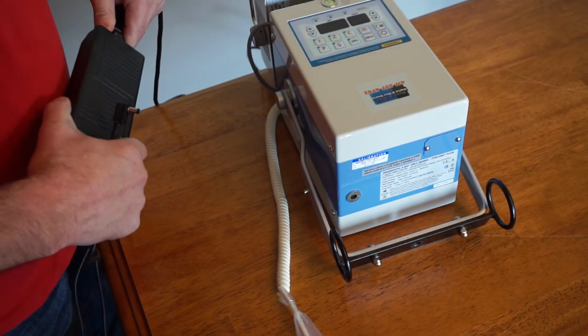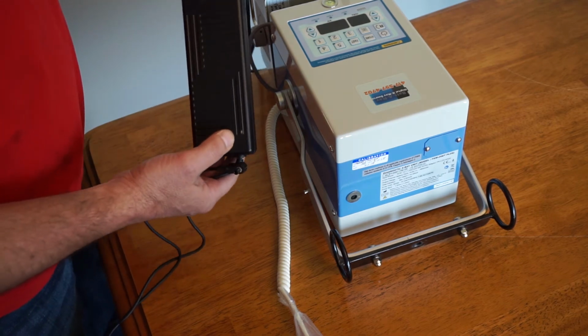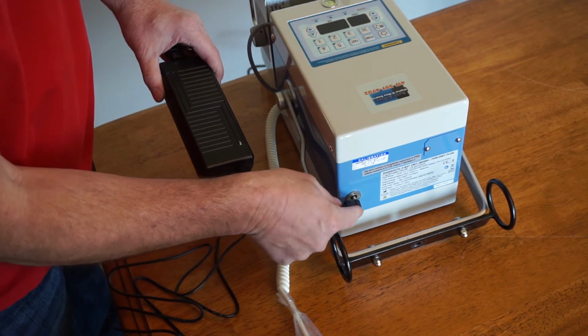Okay, I'm going to show you how to charge the Batt-A-Ray. When you first plug it in, this green light on the charging brick will come on. And the charging port on the machine itself is right there.